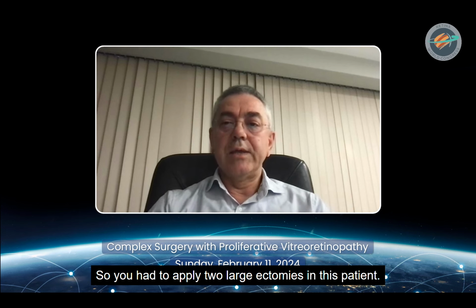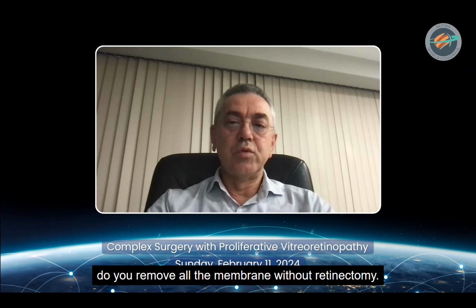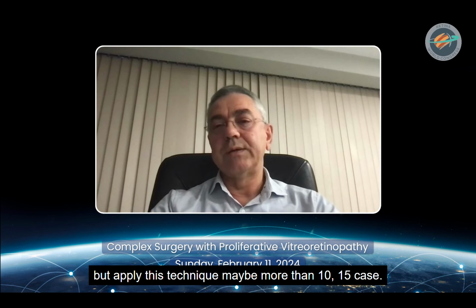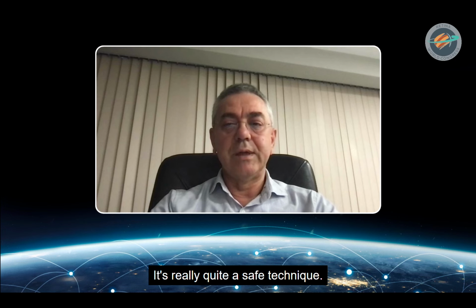So you had to apply 2 large retinectomies in this patient, but with that technique you can remove all the membrane without any retinectomy. Usually the surgeon hesitates about hemorrhage and bleeding during the transcameral approach, but I have applied this technique maybe more than 10-15 cases, and actually there is no hemorrhage problem, there's no bleeding problem. It's really quite a safe technique.